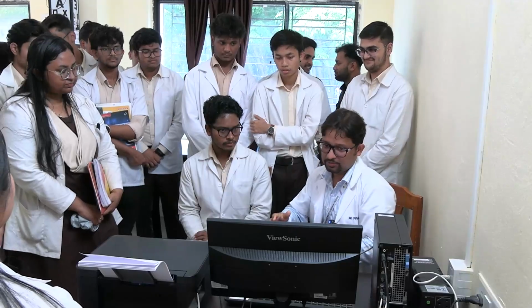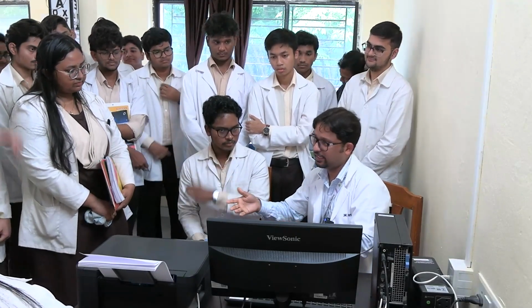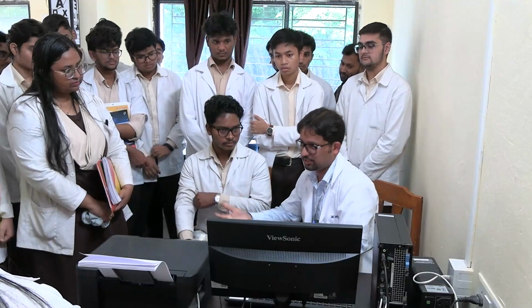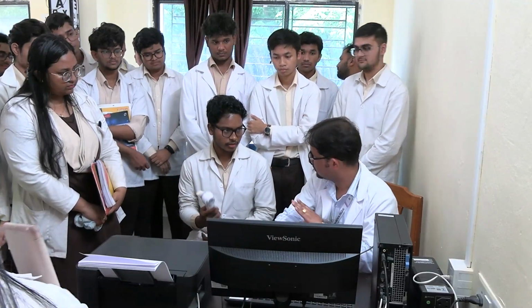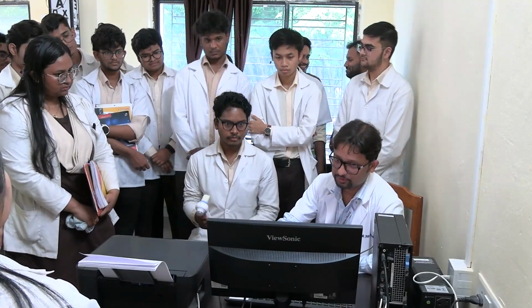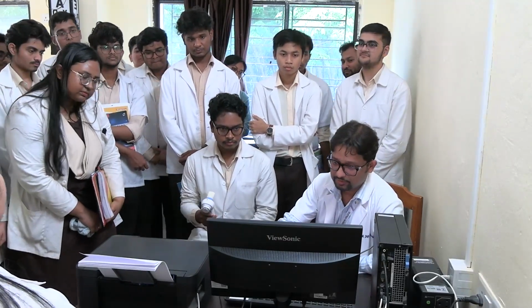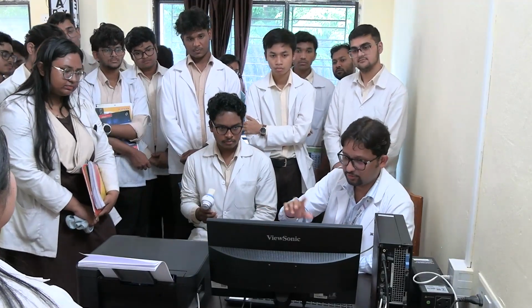So preferably the effort should be to continue at least till 5-6 seconds. 6 seconds is the ideal they tell. You should be able to stretch it as much as you can. Is the process clear? The inhalation should be taken from the mouth. Yes, mouth. Okay. So once you have this graphic, that means the connections and all are fine. Now you're good to go.